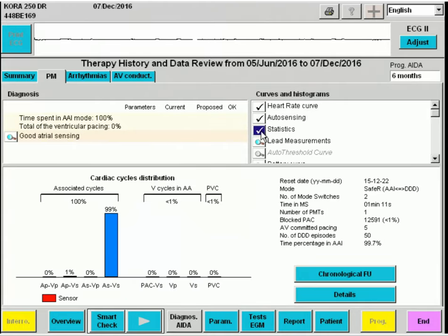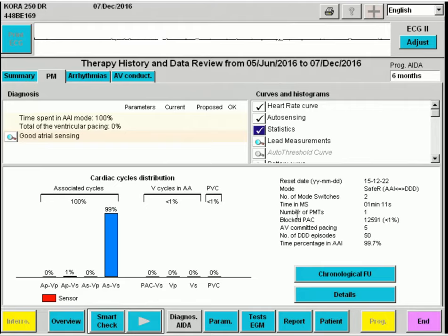Statistics will reveal global pacemaker functioning. We see that most of the time the patient is in intrinsic rhythm, both in the atrium and in the ventricle, and that the safer mode is nearly always active. Other important information is displayed here, such as the number of pacemaker-mediated tachycardias — one in this case.